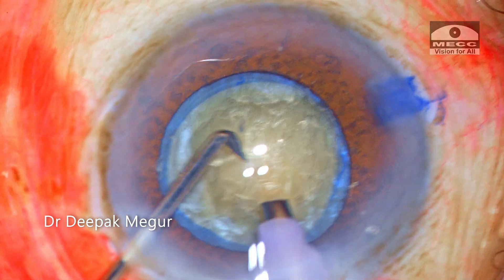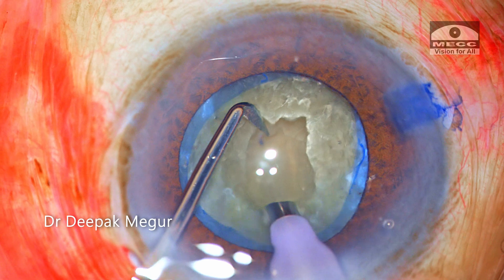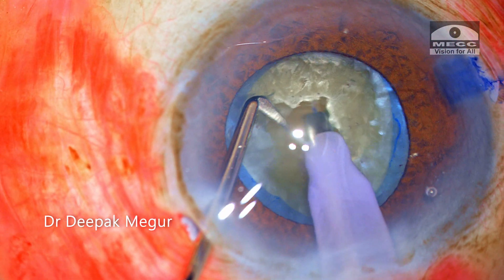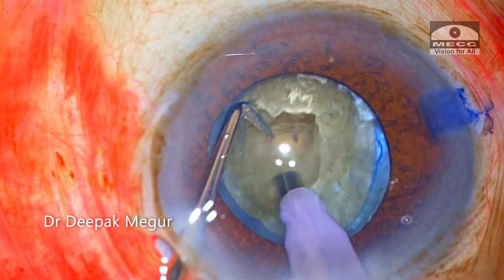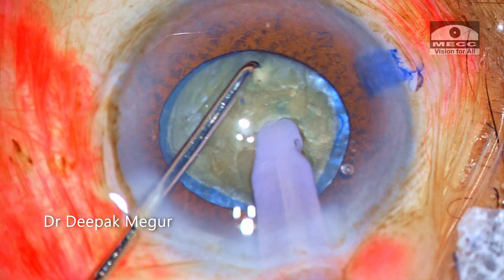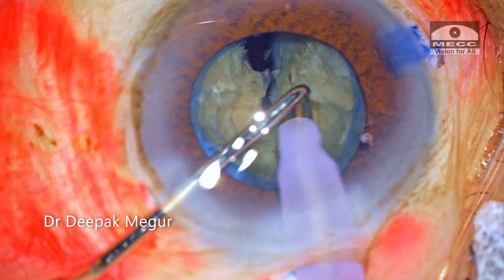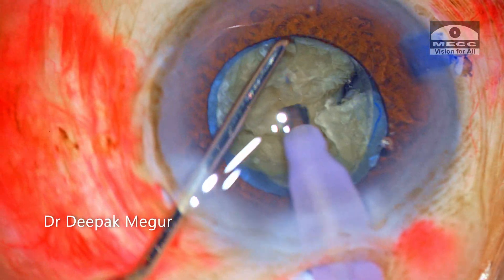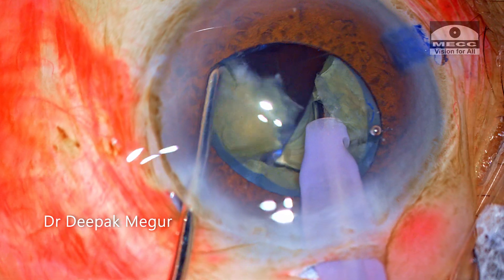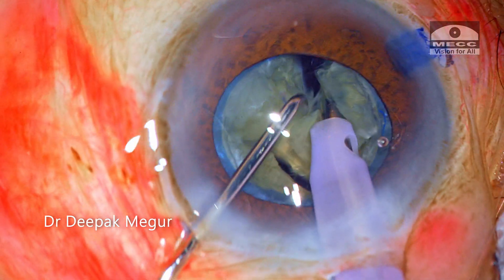Now is the time to phaco. I am performing a central trench since the nucleus is slightly bulkier, so that I can get nice access to the deeper part of the nucleus. Once I have achieved about 50% depth, I bury my phaco tip and begin to chop — this is my preferred method for chopping in such a dense nucleus. The tip is buried nice and deep up to the level of the sleeve, then the chopper goes vertically down and I perform lateral separation. The chopper needs to be repositioned and lateral separation repeated to achieve a complete split. This process of nucleus division is continued — hold the nucleus, bury it in the central portion, chop vertically down, and perform lateral separation — until I have six pieces.